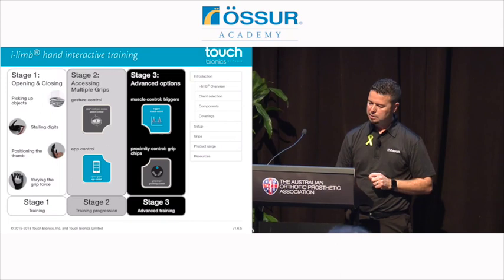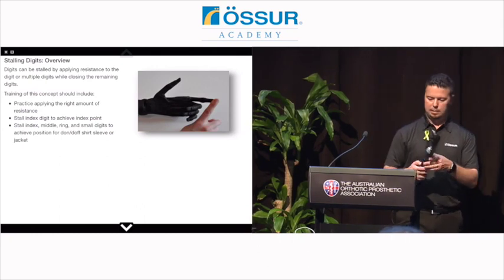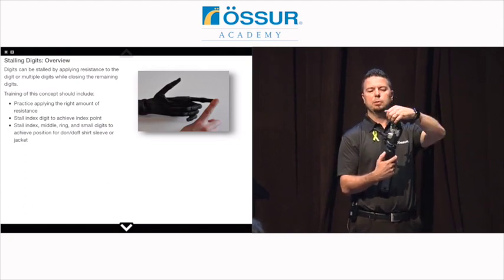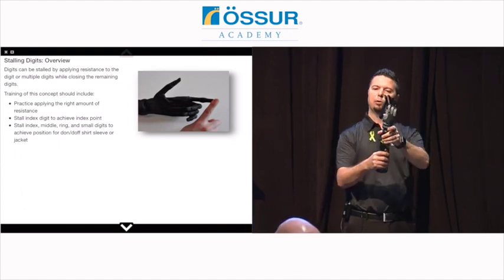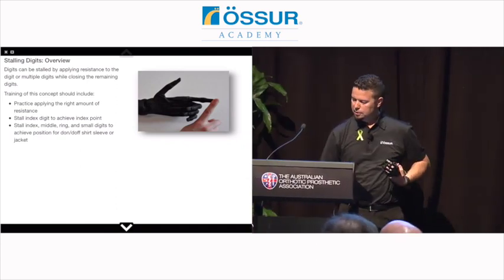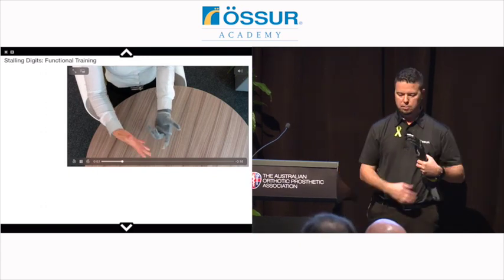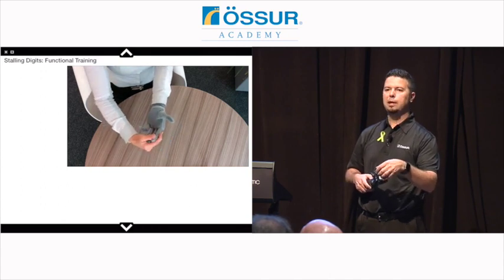Another thing that we show somebody in stage 1 is stalling digits, the ability to stop a finger from moving. And if you remember, that's all possible because we have a motor in each finger. And we can stop multiple fingers. For instance, if you want to get your hand through a coat sleeve, you could stop four of the fingers, have the thumb closed, and now you're in a low profile position to put on a coat. Make sure that they understand the amount of force that's required to hold that digit or digits in that functional position. A nice little test to do that is have them stall each finger individually so they get a feel for that.